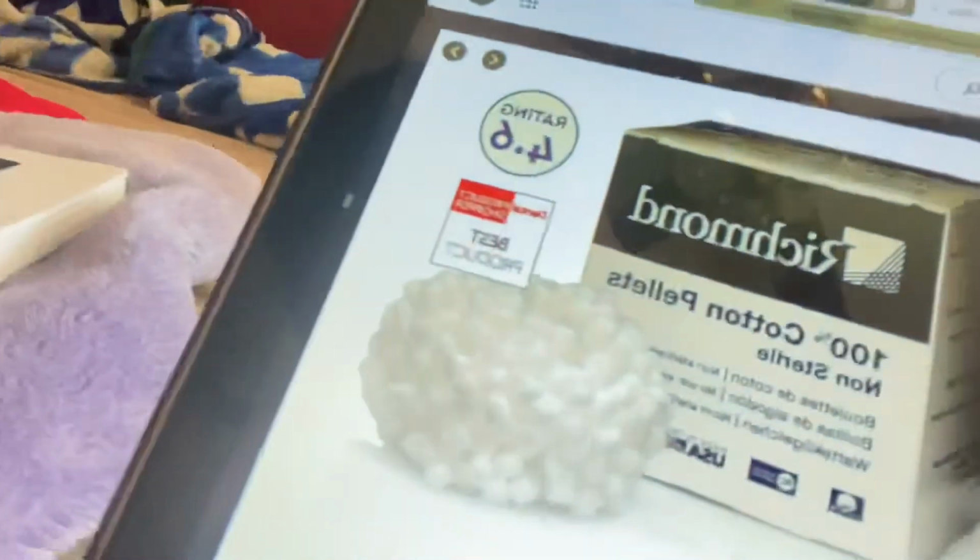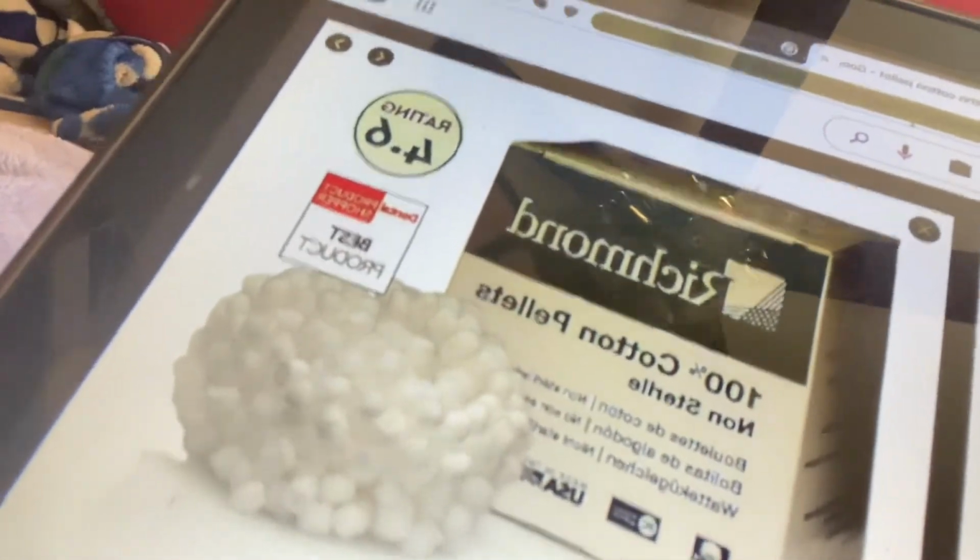And then next, we're going to place a temporary restoration over the gutta percha, which looks like this. We're going to use Cavit with cotton pellets to look like this. And then when that is done, we're going to take a final x-ray, another periapical x-ray, for a couple reasons.